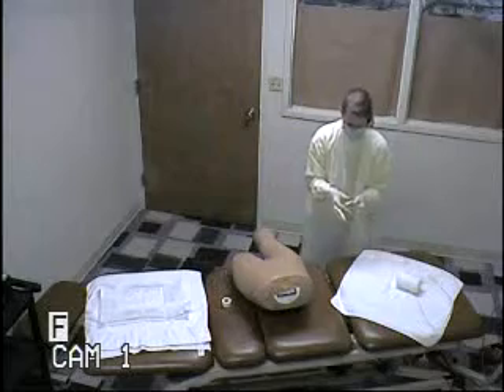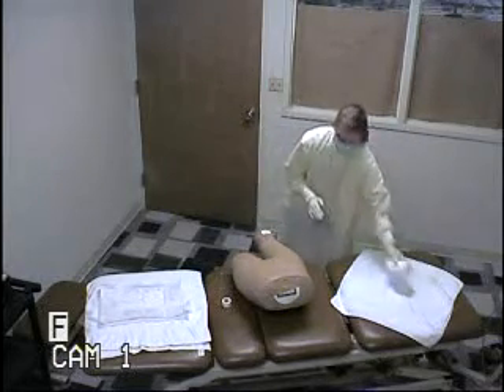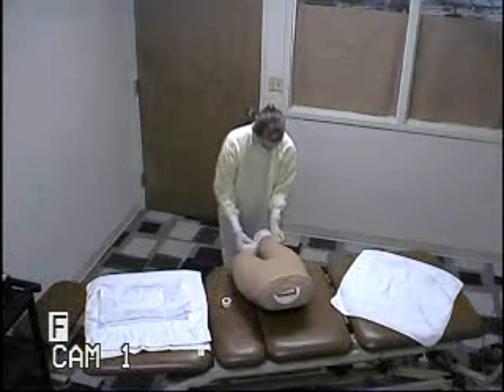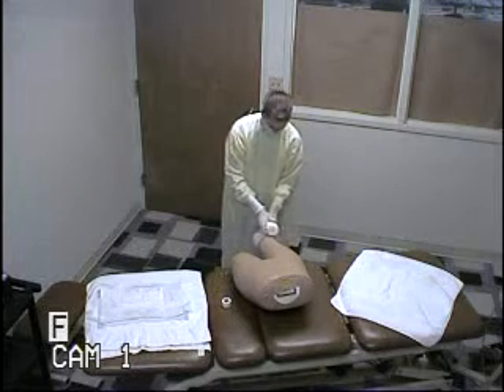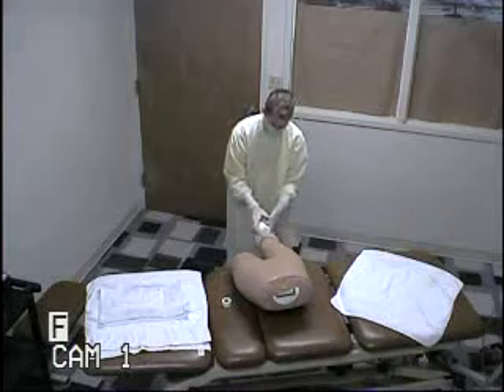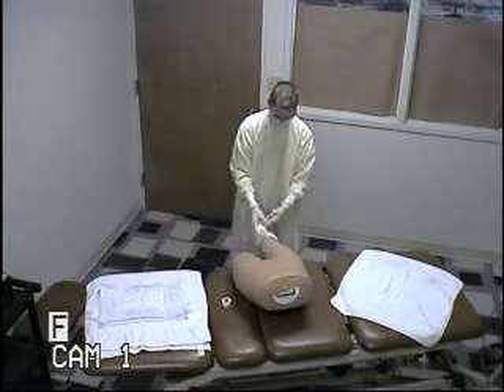And then I'm going to take my two-by-two dressing. Put it over the wound. And then I'm going to apply my curl-ex to my patient. I'll put one more time just to make sure that it's secure.